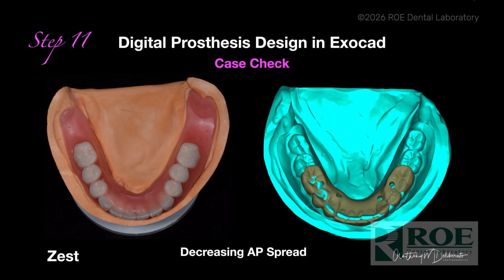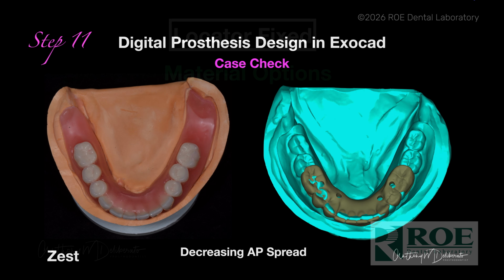Okay, so they've scanned my setup, and they planned, as you can see in the green, the LOCATOR Fixed prosthesis. And you can see that the setup has additional teeth going posteriorly, but I always do that because it helps me with the position that I want those teeth to be in based on the anatomical landmarks, and so that I can have my upper denture teeth in the right spot. So it just helps improve the quality of the overall case.